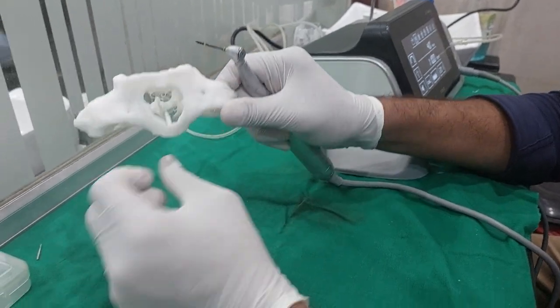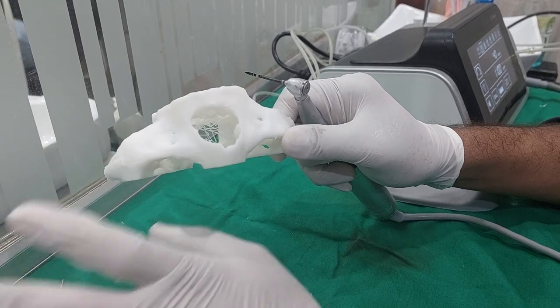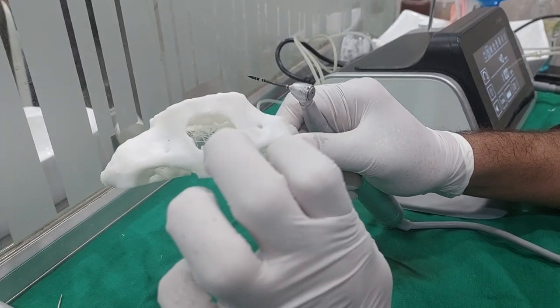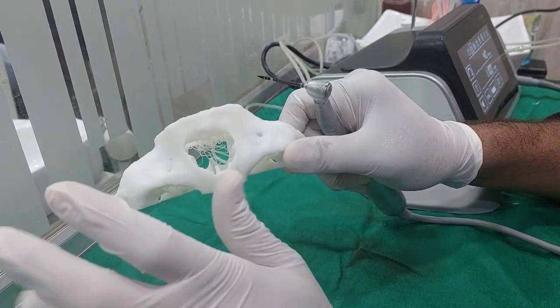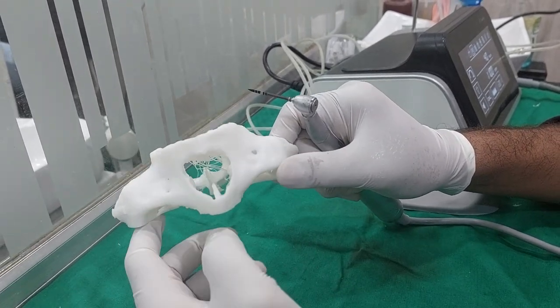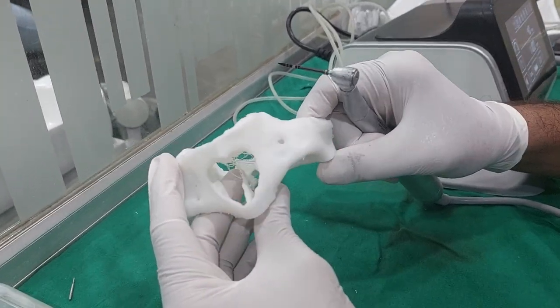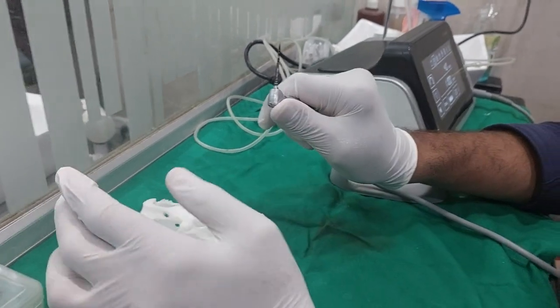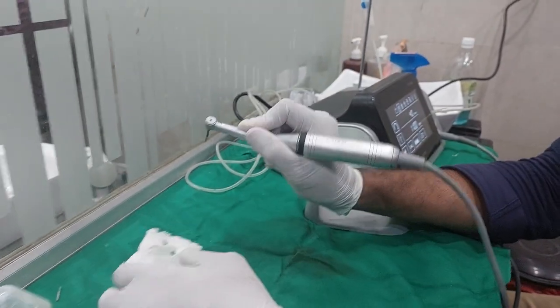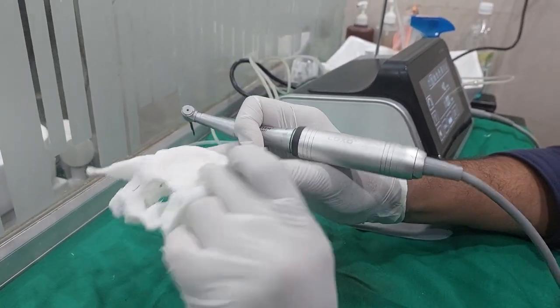This will avoid the complication of bleeding, because if there is bleeding from an implant site we can stop it with compression. But posteriorly and inferiorly, bleeding in that region cannot be stopped with just compression. Dentists have only compression and basic suturing available. Otherwise, it is difficult to manage that complication. So to avoid this, choose a drill of 20-25 mm length, as an average of 18 to 20-22 mm length reaches to the pterygoid area. Now we will start with the demo.